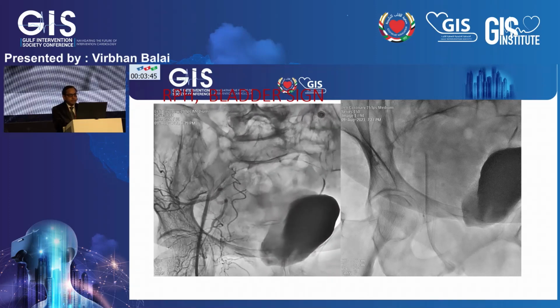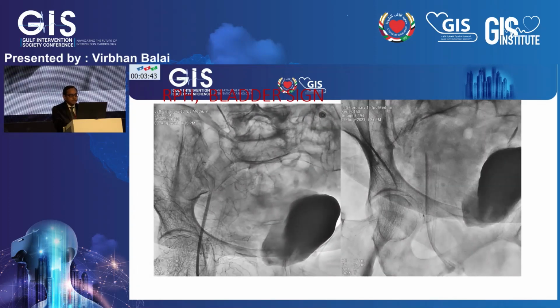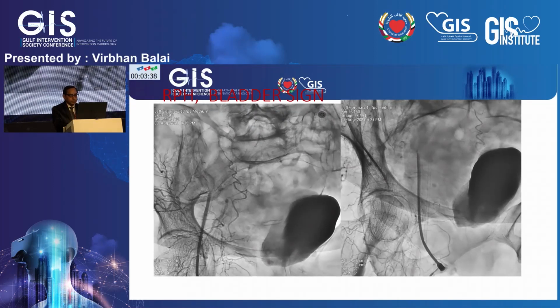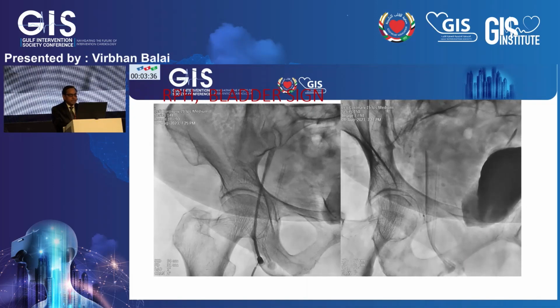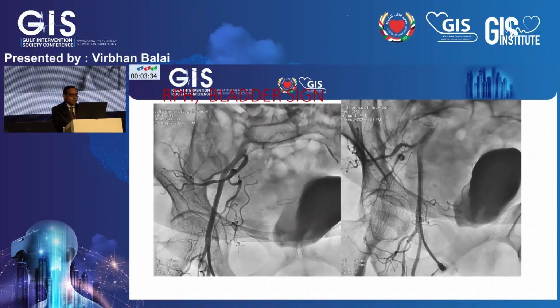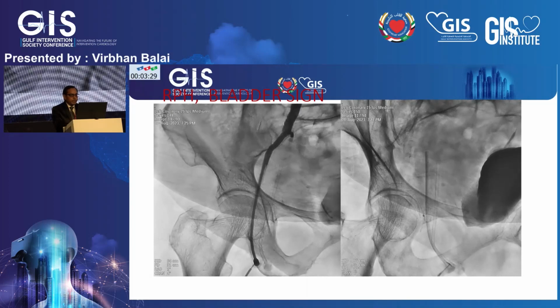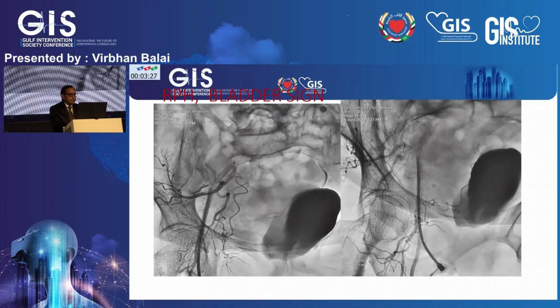And then the check angio was done. The bedside echo was done, which did not show much collection in the pericardial space. But the patient's pressure started dropping again on the table. So we decided to have a look at the right femoral artery access site.